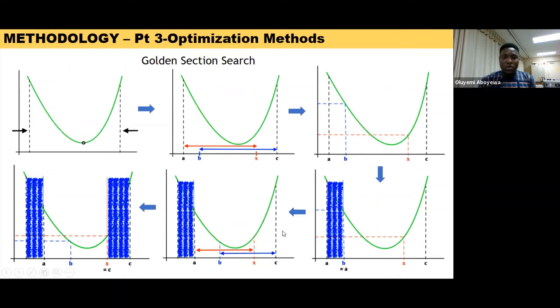They keep on shifting. So this is not a derivative method. They're just looking at the least value returned by searching at different ranges of values. That's what a golden section search does. This is just a graphical representation, not getting into the weeds of this here.